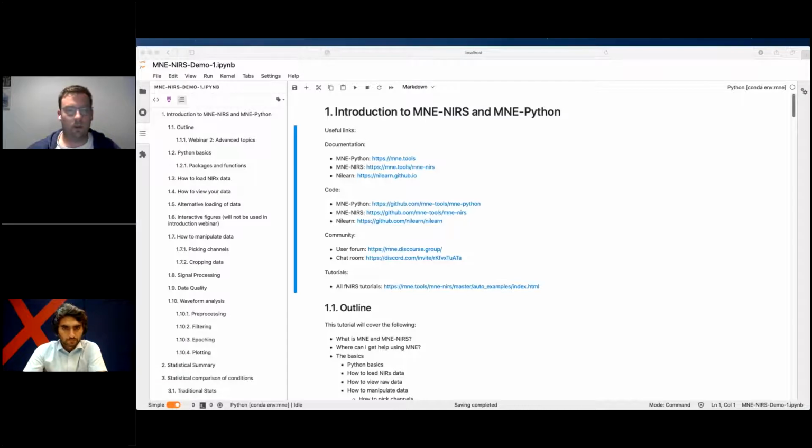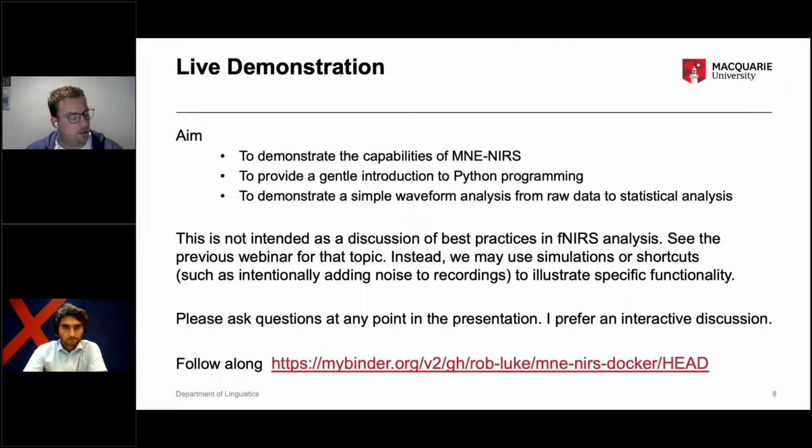And so today, for the rest of this talk, how long do I have? I'm 15 minutes in already. So we're going to give a little live demonstration of MNE that I hope you can all follow along with. There's a link at the bottom here, which if everyone who wants to follow along could click on that, it will open up an MNE Python notebook for you to follow along with. Or if you probably can't click my screen, can someone put it in the chat? I think I put it in the chat before.